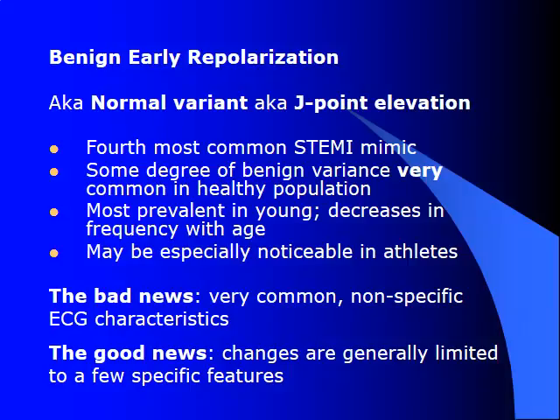There are some very common non-specific ECG characteristics, but the changes are generally limited to some features that we'll talk about.